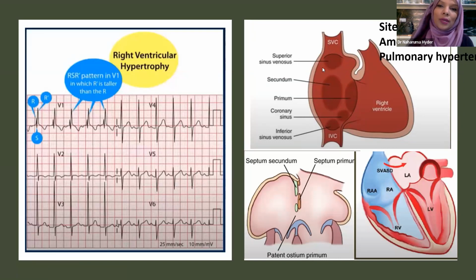And how do we determine the sinus venosus ASD? We know there is a defect in the SVC location. So when there is a defect, the sinus node is sometimes not located in the usual site. It may be towards the left lower quadrant, near the AV node. So sometimes we get abnormal P axis and short PR interval. So the axis of the P and QRS can help classify the ASD.